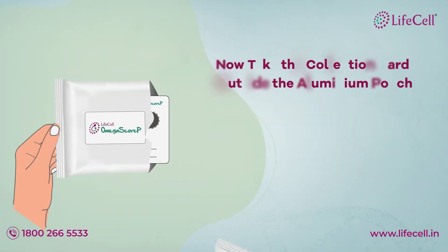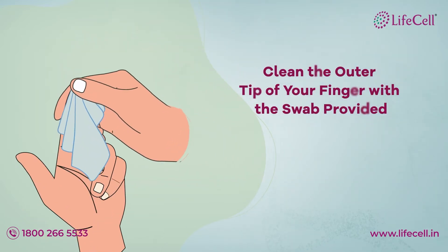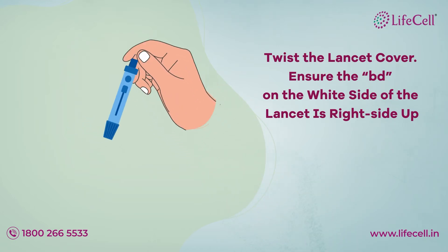Take the collection card outside the aluminum pouch. Clean the outer tip of your finger with the swab provided. Twist the lancet cover, and ensure the BD on the white side of the lancet is right side up.